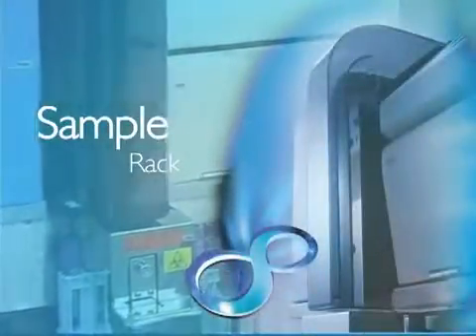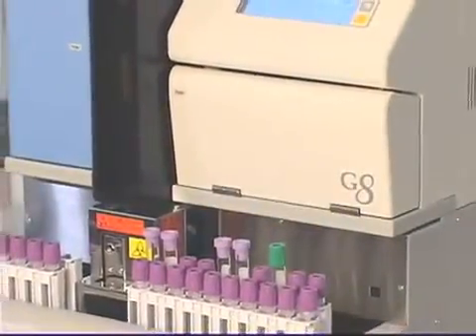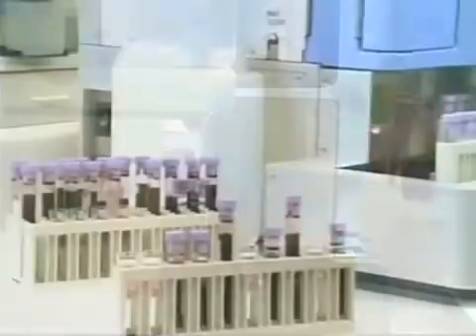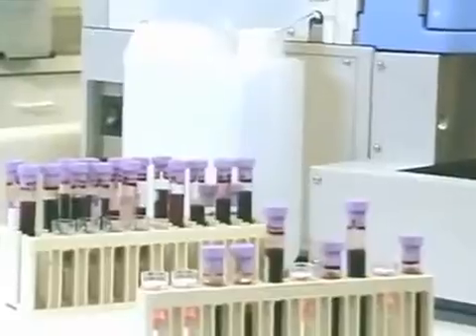The sample rack is spring-loaded, so tubes of 12, 13, 14, and 16 mm can be placed on the system, and sample cups and tubes can be placed randomly in the sample rack.